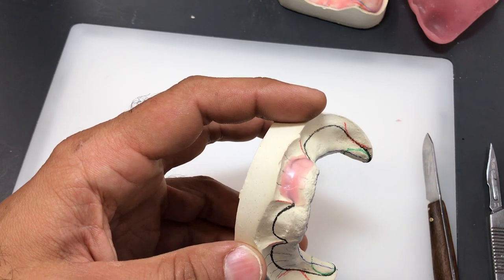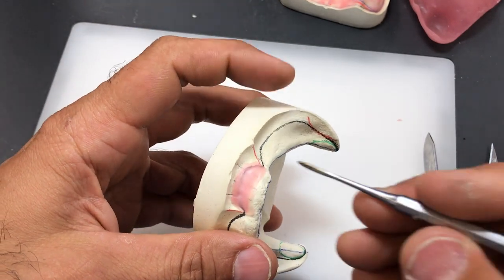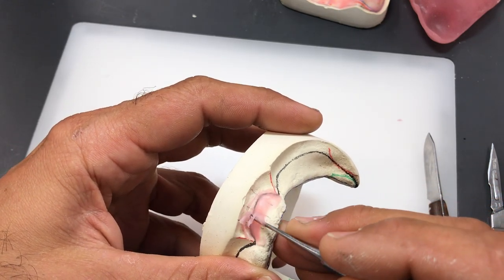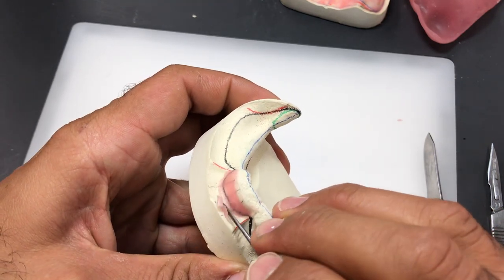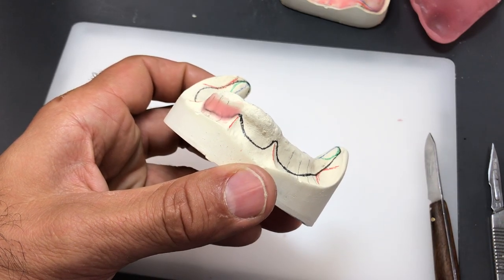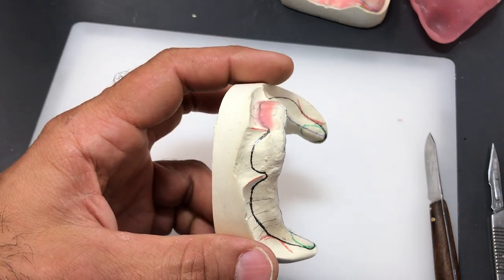Now, having nice control of your wax means that you don't have to go back and carve things excessively. And I'm going to trim it. Notice that my wax, the block out of the wax, is beyond the outline, and that's okay. You don't have to stay to the line. You can go beyond the line.